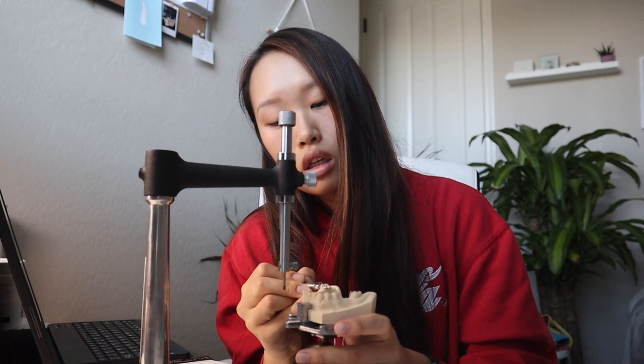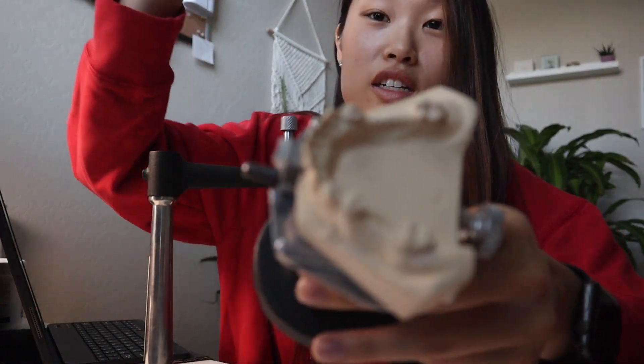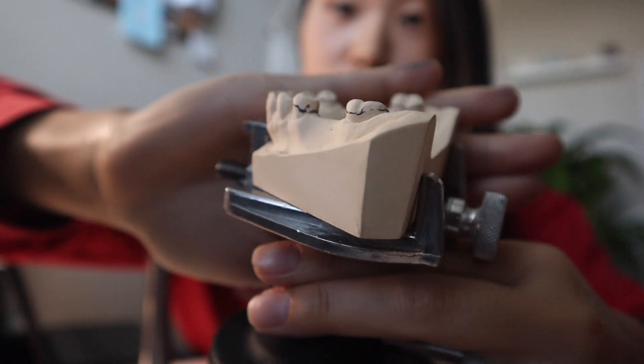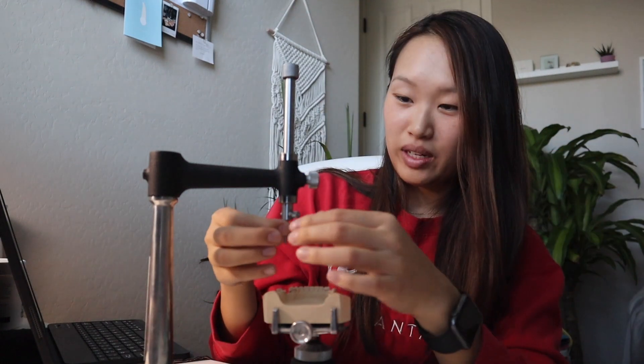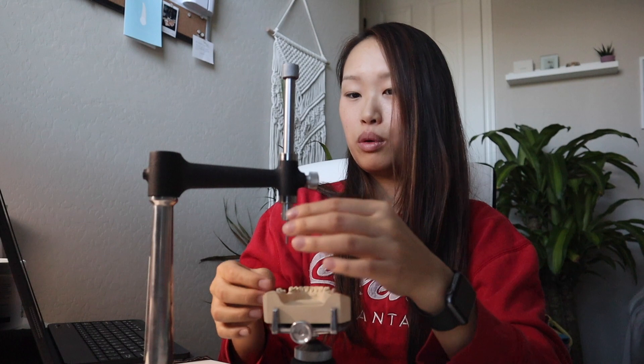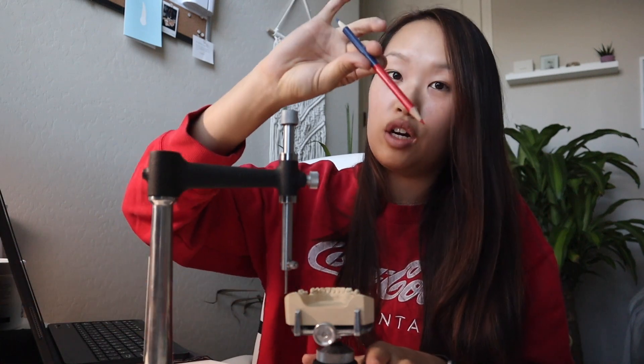This is the eraser that we use for the cast. Once you're done it should look something like this. Now I'm going to mark the undercuts and this is when I would use the undercut gauge. I feel like a makeup artist. Anyway, this is a lot more nerdy and boring I guess, but gotta do what you gotta do. It's going to leave a very very slight marking, and what we're going to do is mark it with our red pencil.